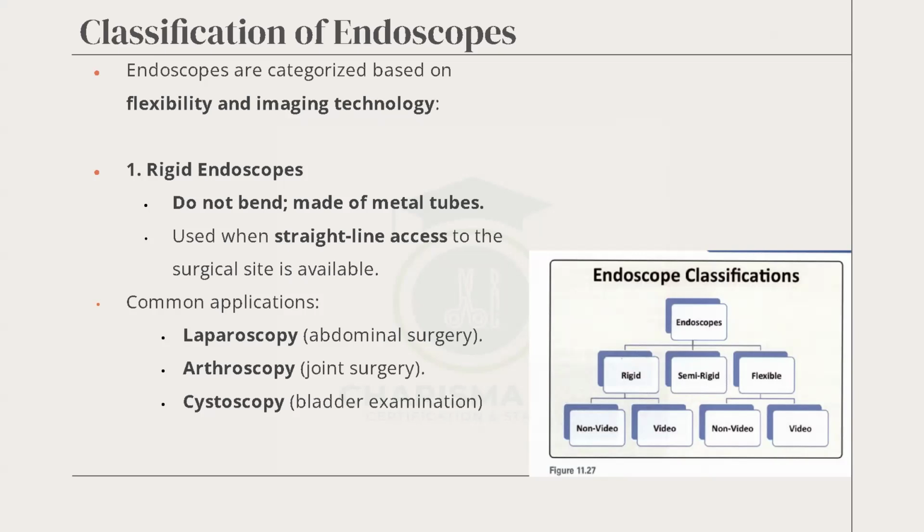Flexible endoscopes, by the name, are easy to bend. But because they have fibers or lenses in there, you cannot bend and squeeze them as if you mean to break them, just trying to damage them. Flexible means it can be coiled around.